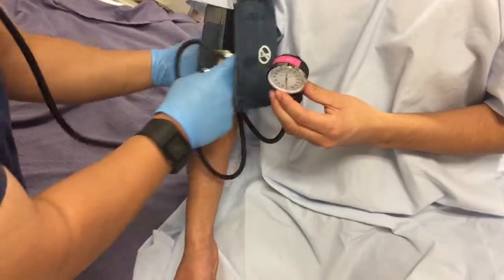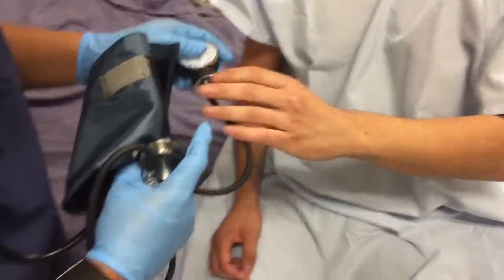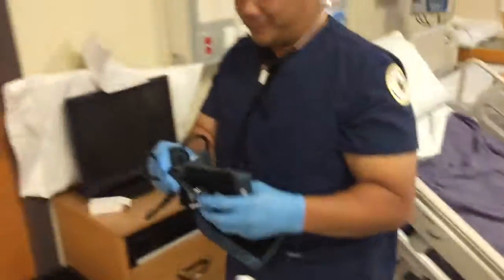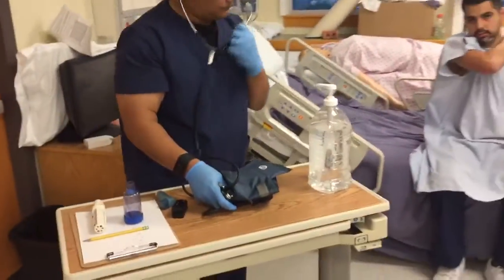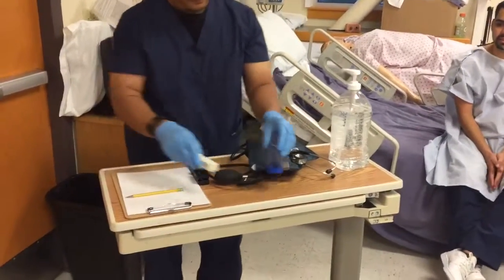So I got 119 over 78. Is that about right for you? Sounds pretty good. Over 78.